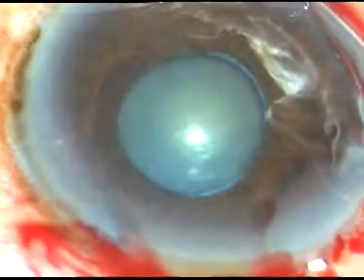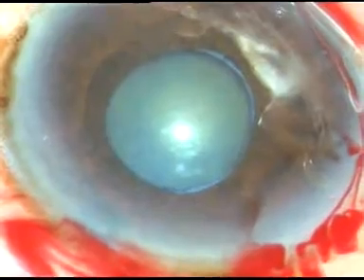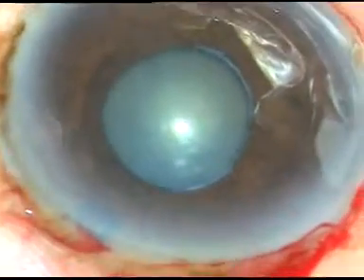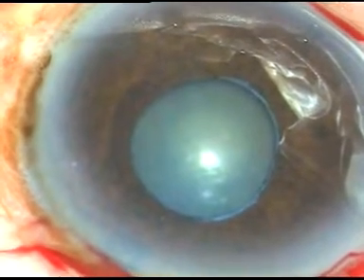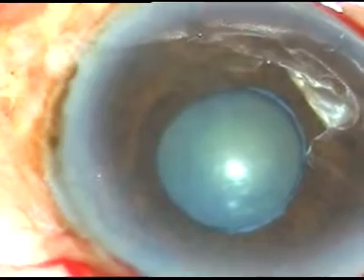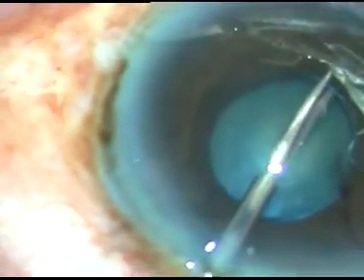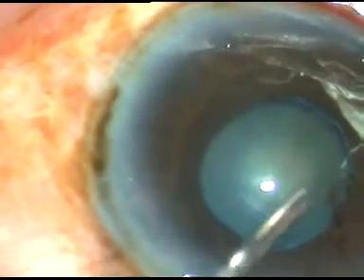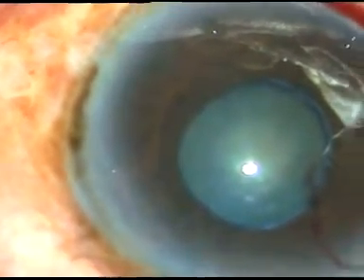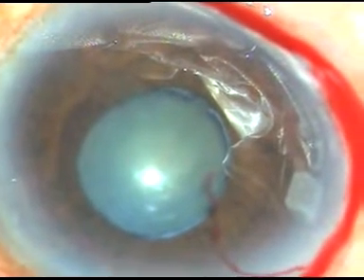One side port has been made; another side port is to be made on the right side because I have to manipulate the B-hex hexagonal device. This is a side port and this is the left eye of the patient. The eye is deep-seated and the patient has a protruding nose. Here goes the vitreous scissor — I am just cutting the band at two points. I am not cutting the sphincter, just the band, at two points: at 8 o'clock and at 9:30 o'clock. I have cut the fibrous band.